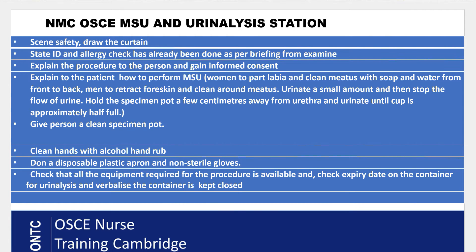Clean your hands with hand rub, apply a non-sterile apron and gloves, then check your equipment. Check the expiry date on the box of strips to ensure they are within date. If the box has been opened, strips can be used for one year — check the date of opening. Also ensure the box has been kept closed so the strips have not been exposed to air.